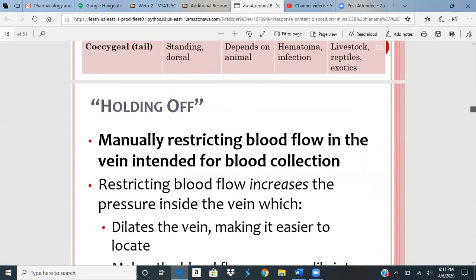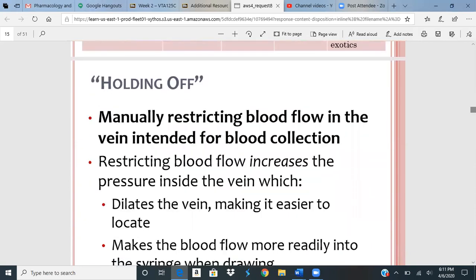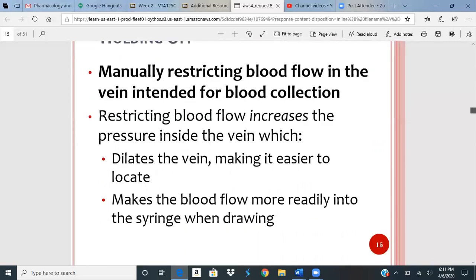I mentioned holding off. And really what that means is you are just restricting blood flow. So then it makes the vein pop out more. It's easier for you or the person drawing to see. And then it's dilating the vein. You're putting pressure on that vein, so it's going to pour into that syringe when you're drawing back to get the blood.